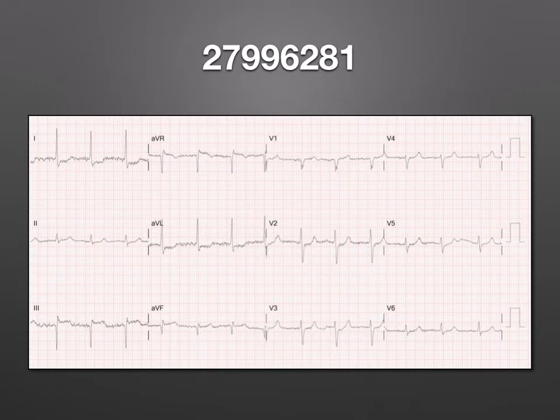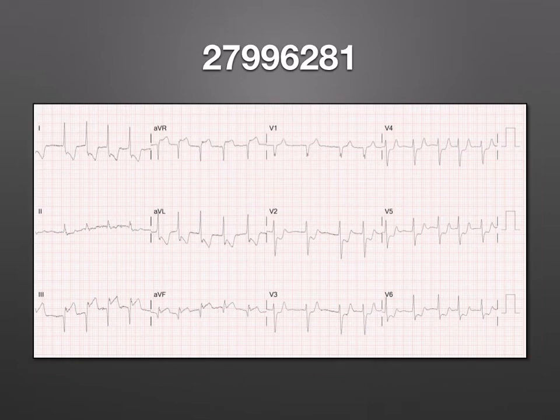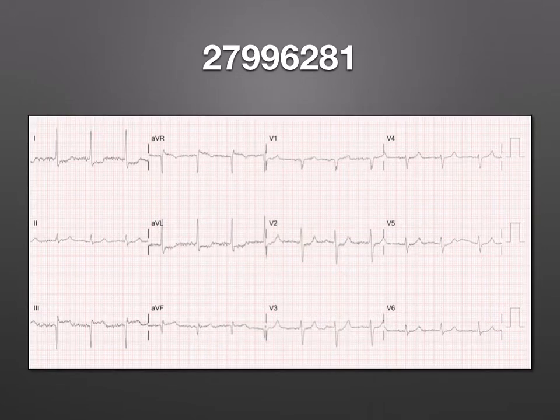Here's the additional ECG. So you still see some elevation, you still see some depression, but let's go back and take a look at the initial one. It has gotten much better between this ECG and this ECG. Just an interesting little aside.